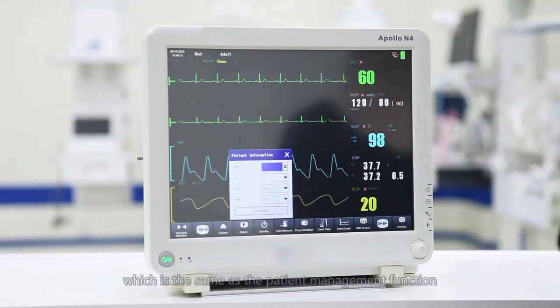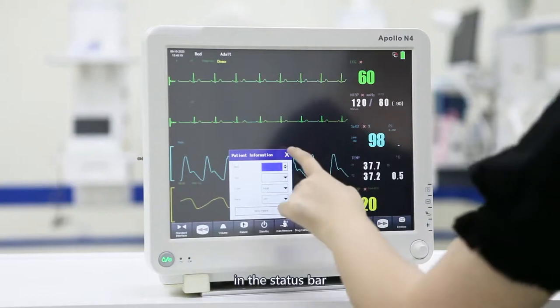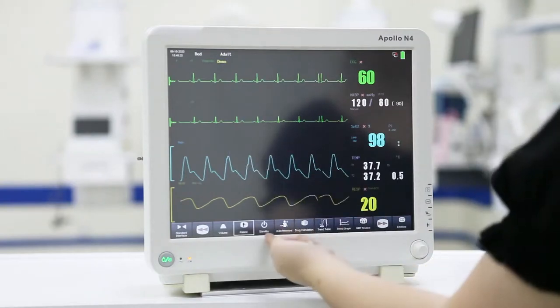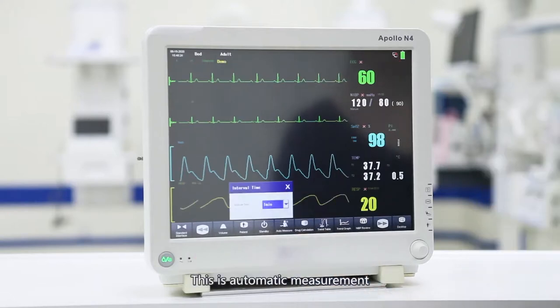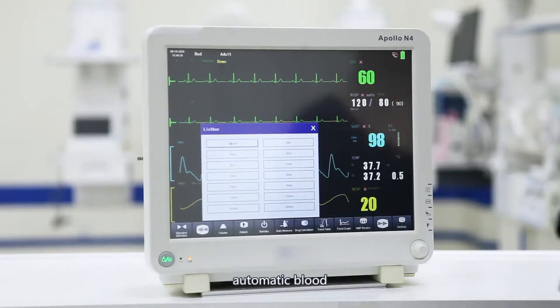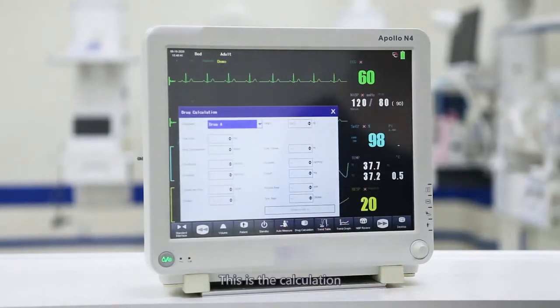This is patient management, which is the same as the patient management function in the status bar. This is the system standby, where you can set the shutdown. This is automatic measurement; you can set the time interval for automatic blood pressure measurement. This is the calculation of drug concentration; you can set the total amount, concentration, dose, and other values of the drug to facilitate reference of data during medical rounds.